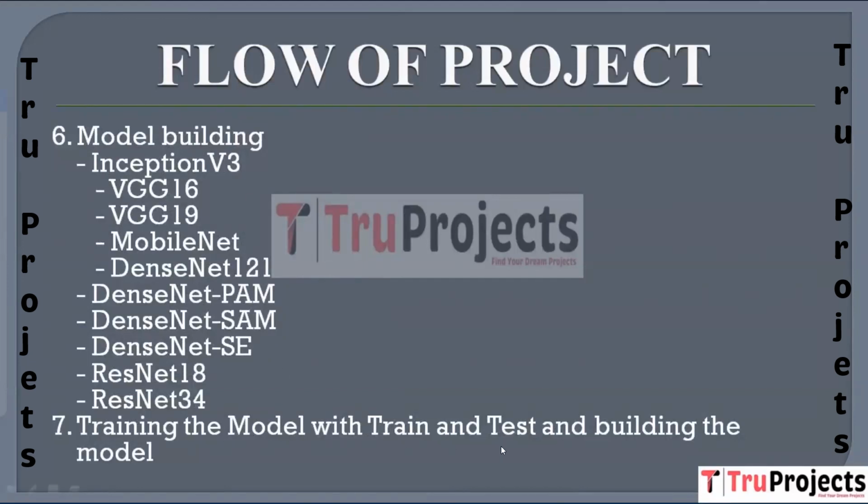Next, here we have training the model with train and test data. This step involves training your selected models on the training data and then evaluating their performance on the test data. The training process includes optimization algorithms like gradient descent and backpropagation. The trained models are built and ready for inference.